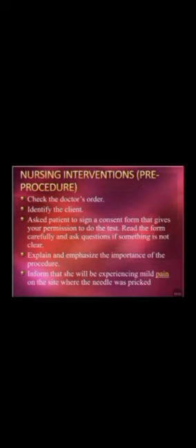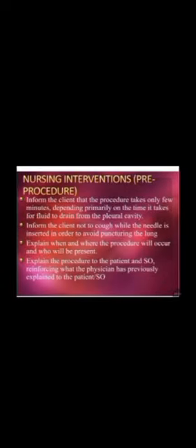Check the doctor's order, identify the client, ask the patient to sign the consent form that gives permission to do the test. Read the form carefully and ask questions if something is not clear. Explain and emphasize the importance of the procedure. Inform that she will be experiencing mild pain at the site where the needle was pricked.